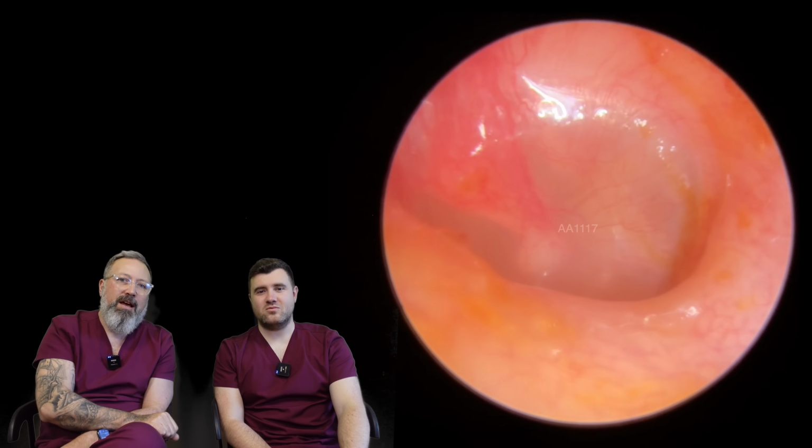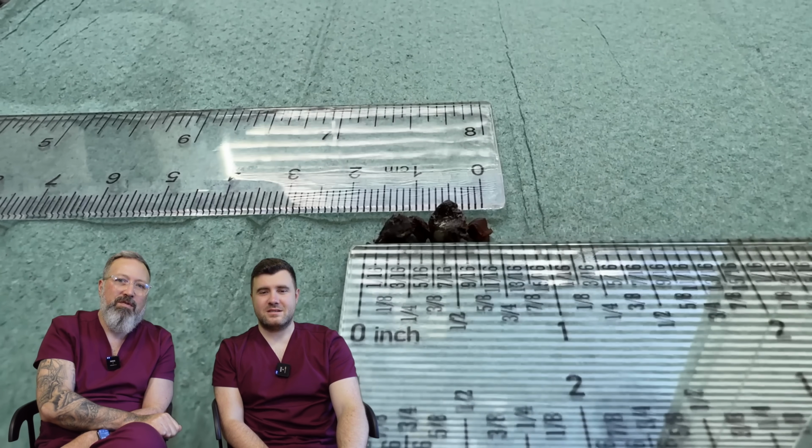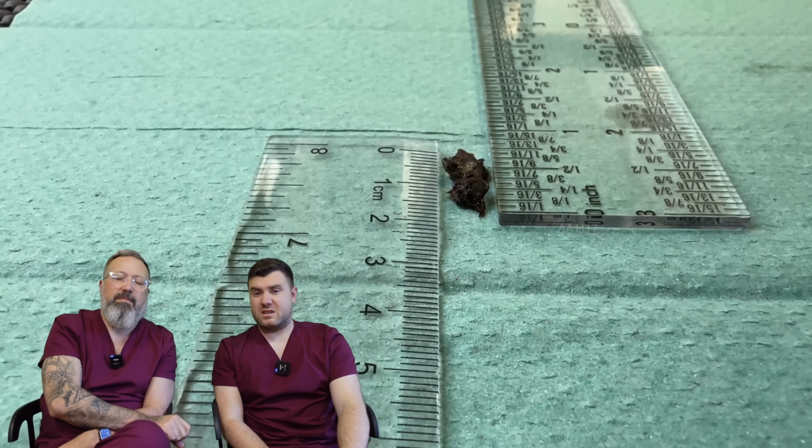There you go. Look at that. Ooh, yeah, a little bit of inflammation. A little bit, yeah. You can see where those blood vessels come to the surface there. So we have three quarters of an inch, 1.75 centimeters, I would say there.